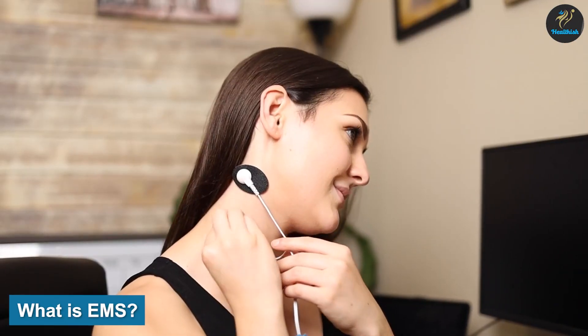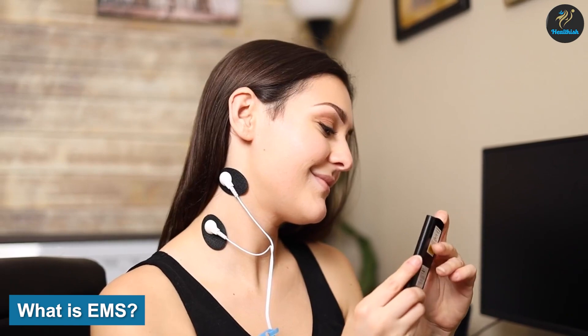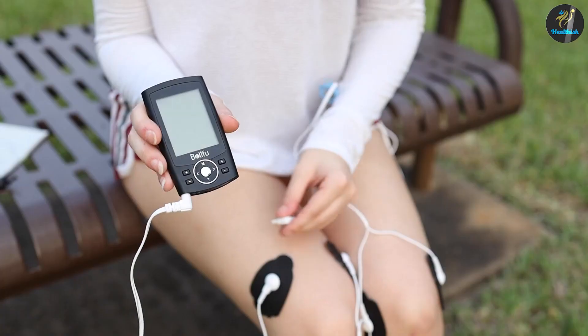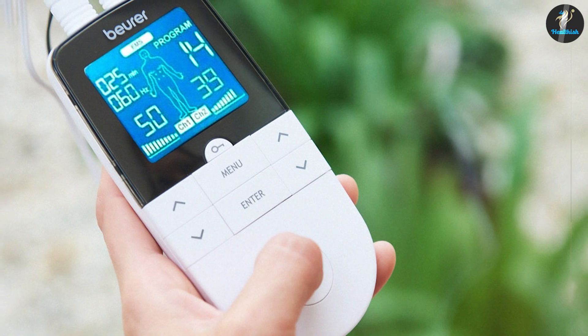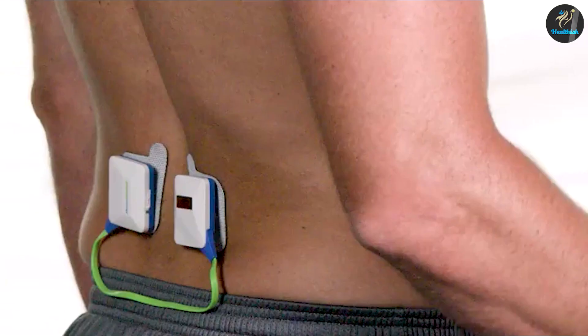What is EMS? Electronic muscle stimulation. EMS is a physical therapy and fitness technique. Like TENS, it involves a machine that transmits electrical impulses through electrodes that are applied directly to your skin. Unlike TENS, though, the electrodes from an EMS machine are applied to key muscle groups. The common muscle group EMS is used on is the quadriceps after knee surgery.